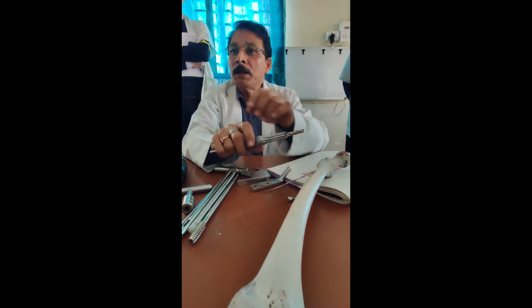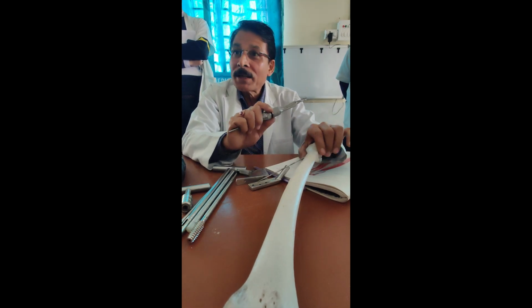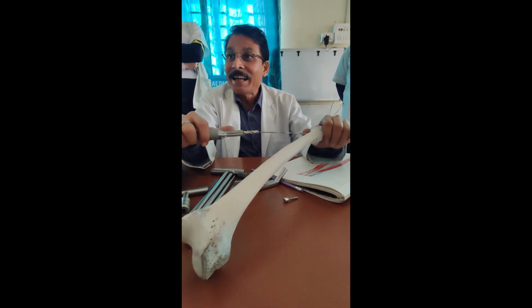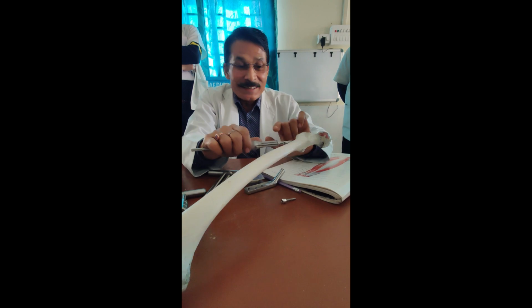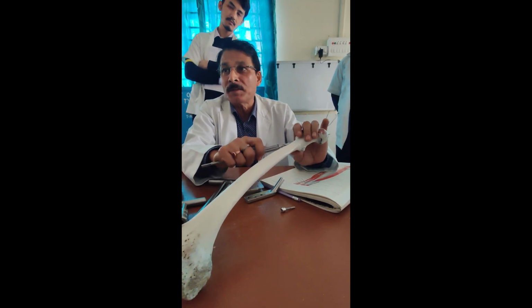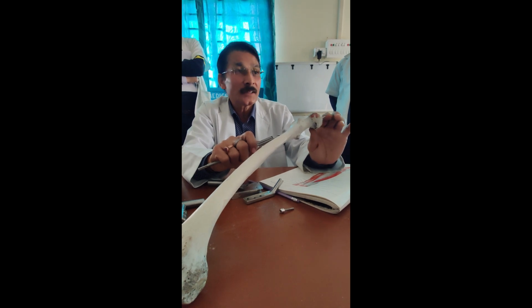And while doing reaming, you are supposed to intermittently take the C-arm view. Why is it important? Look at how it is going. Number two, at one point, sometimes this guide wire may get stuck in the reamer, and while doing the reaming, this guide wire may also move upward. So intermittently you are supposed to see. Very important. Sometimes it may get stuck. It happens many times. It may go inside. That is another disaster. So you are supposed to look at it in between, and again you have to lock it there.